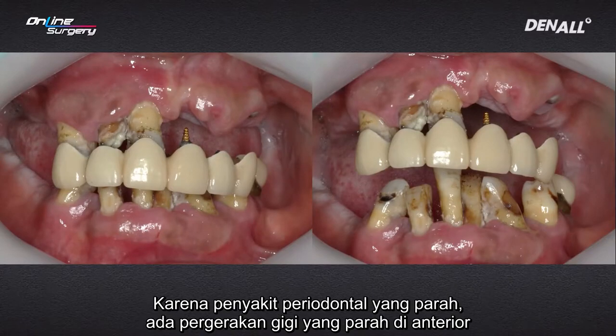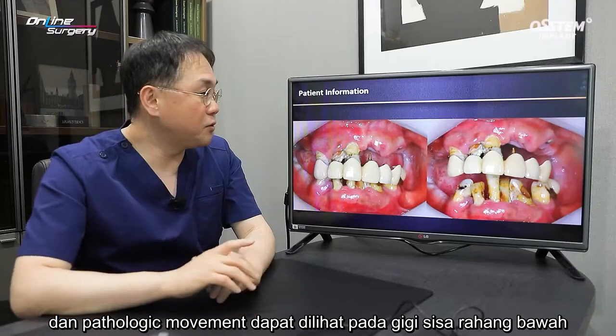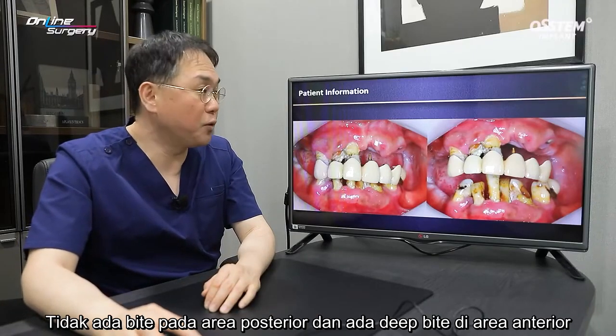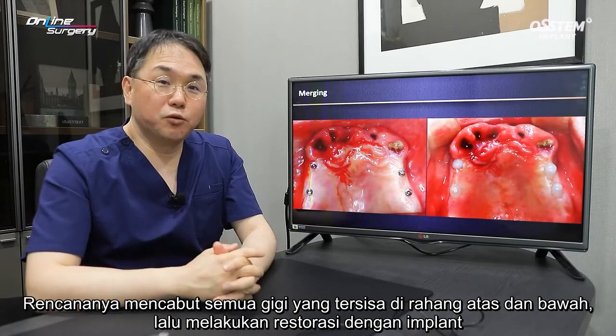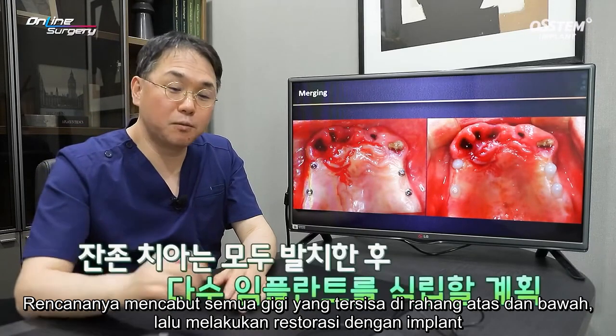Due to very severe periodontal disease, there is very severe mobility in the anterior bridge, and pathologic movement can be observed in the lower residual teeth. There's no bite in the posterior area, so there is a deep bite in the anterior area. The plan was to remove all residual teeth in the upper and lower and to restore with implants.